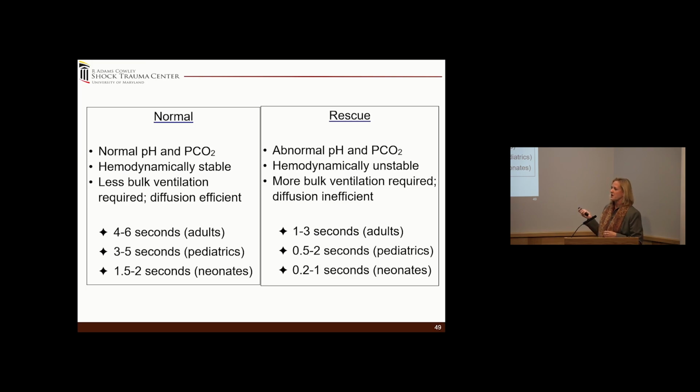So adults, pediatrics, and neonates. However, if you are in a rescue scenario with an abnormal pH, PCO2, like Luigi's patient that he presented, hemodynamically unstable, more bulk ventilation is required. So you're going to use a much lower T-high.